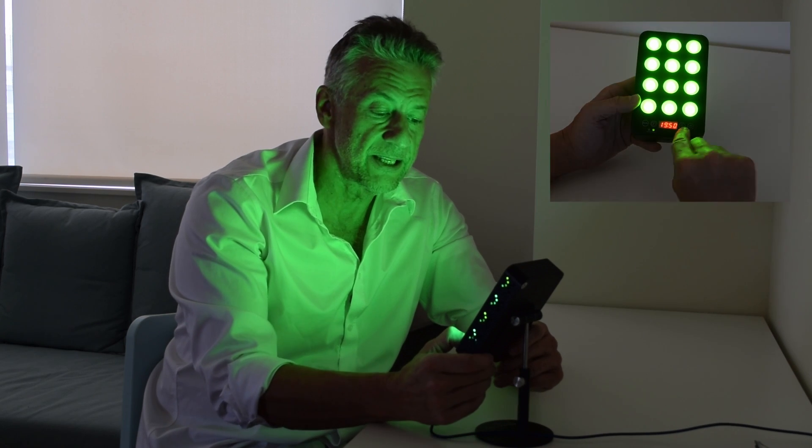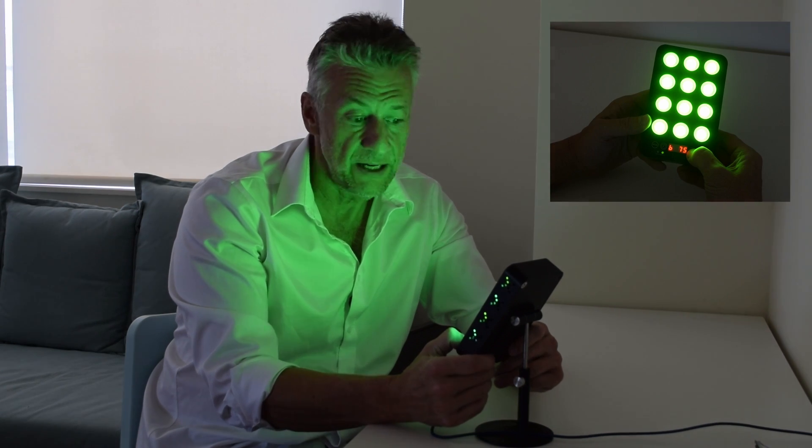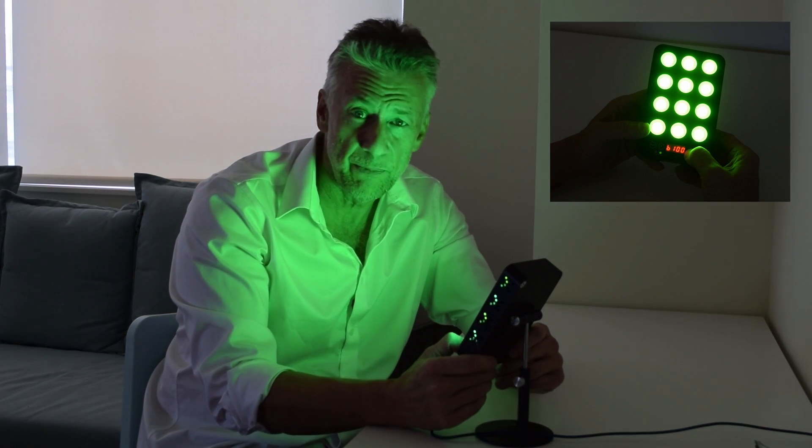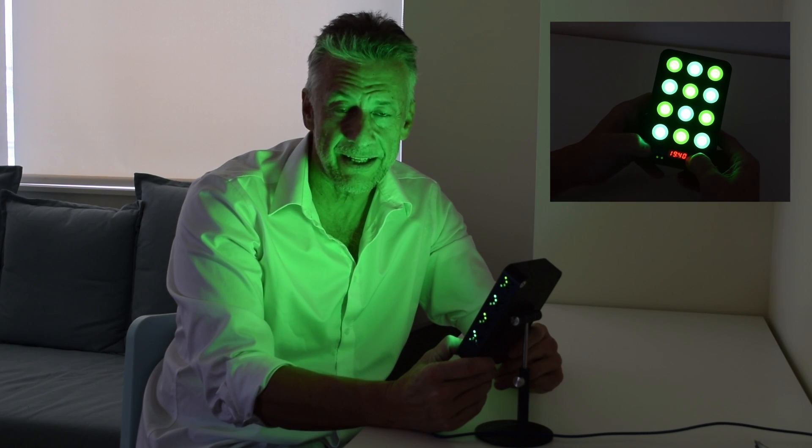You also get to adjust the intensity. There's 25%, 50%, 75%, and 100%. The point is to find the combination of wavelength and intensity settings that work best for your headache.